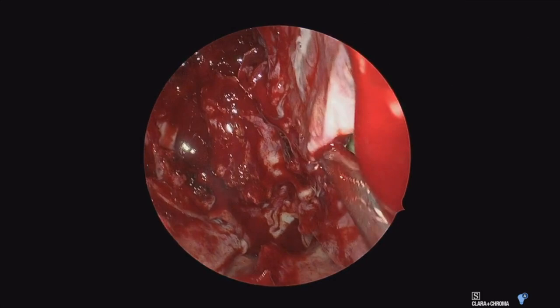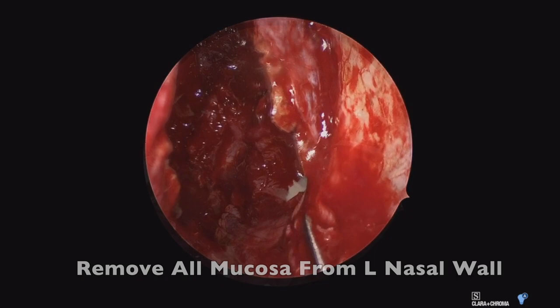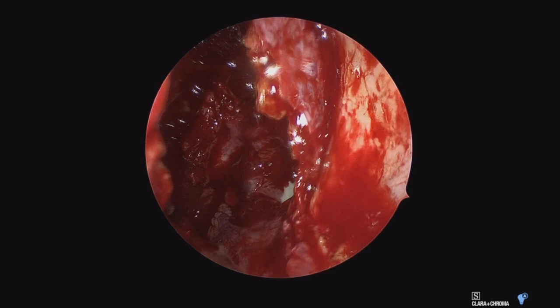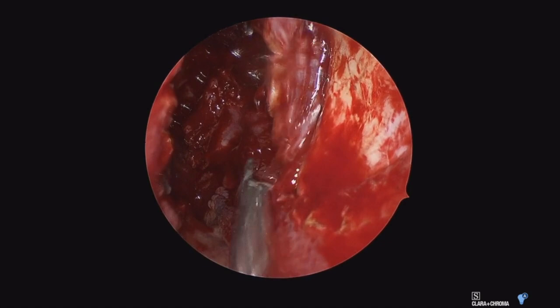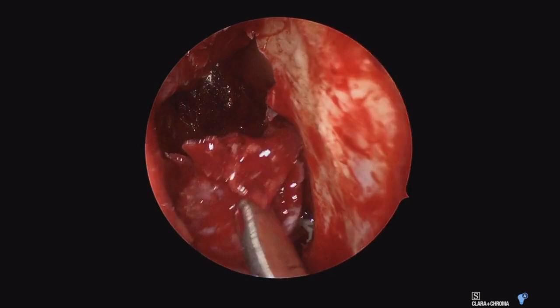The maxillary sinus is secondarily obstructed with mucopurulence in that area. The mucosa there is inflamed, although not directly involved with tumor, and we took samples to confirm that. I'll keep working on the lateral nasal wall, taking this mucosa as it transitions over the nasal lacrimal duct and towards the orbit, carefully peeling all of this mucosa out and beginning to expose the bone of the lamina papyracea and the nasal lacrimal duct.